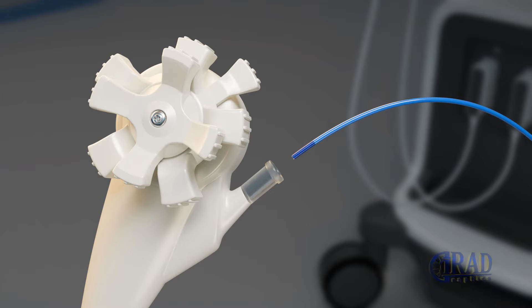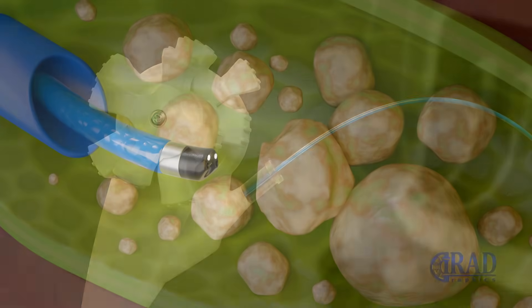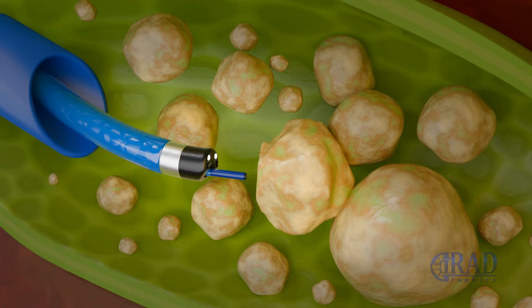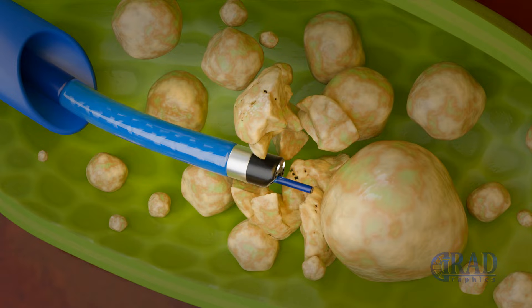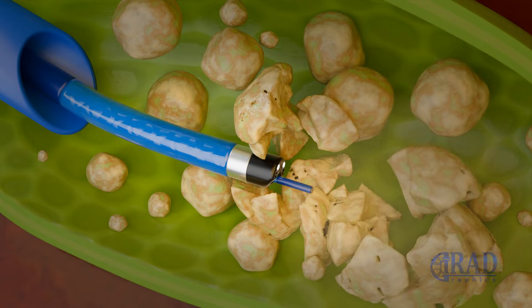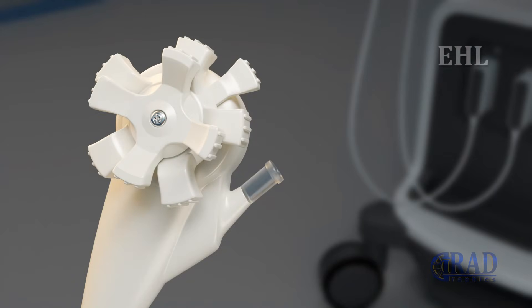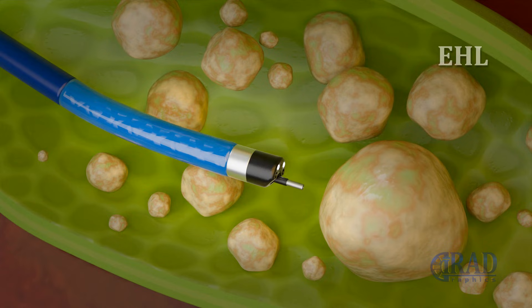As the next step, a laser fiber is advanced through the work channel of the scope, and the Holmium laser is used to fragment the gallstone into smaller pieces. Alternatively, an electrohydraulic lithotripsy probe can be deployed through the scope to fragment the stone using adjustable energy levels and pulses.